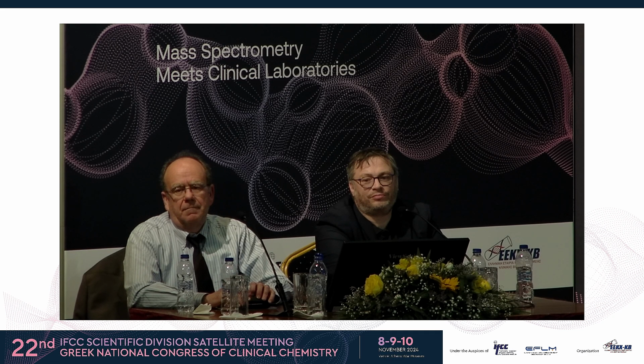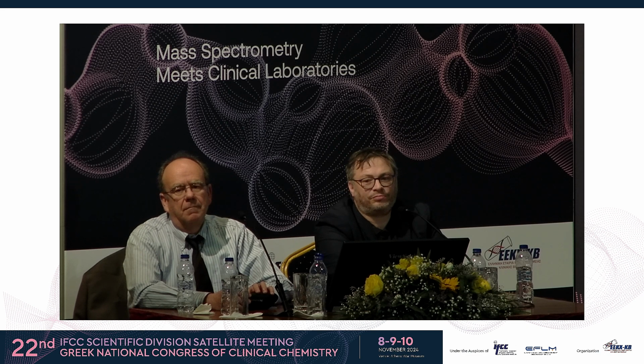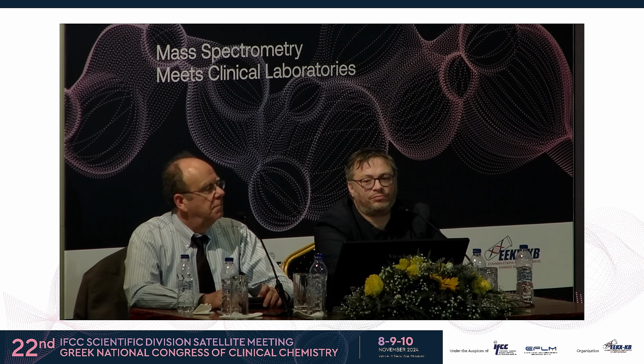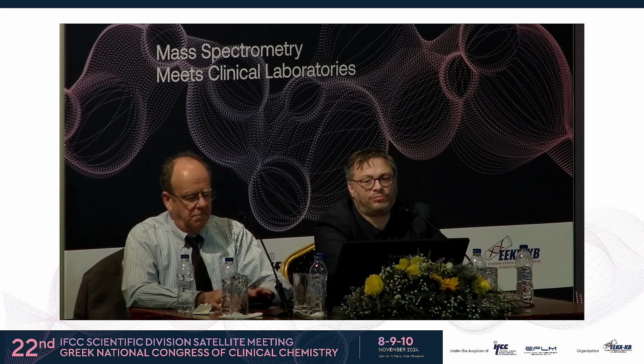There were far too many reactive components. The derivatization reagents were often underperforming because we couldn't derivatize the totality of everything that was going to be looked at in the amino acid profile. So, for example, in tyrosinemia type 1, we added an 8-fold excess of the reagent and waited, I believe, an hour longer than we were supposed to. And every time we did this experiment, increasing the concentration, we kept on recovering more tyrosine.